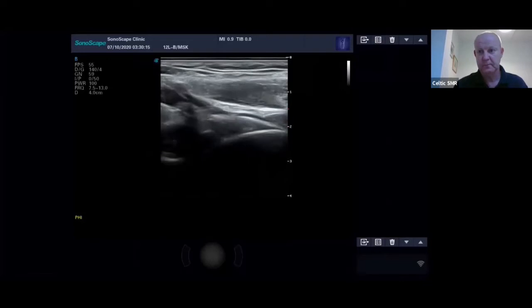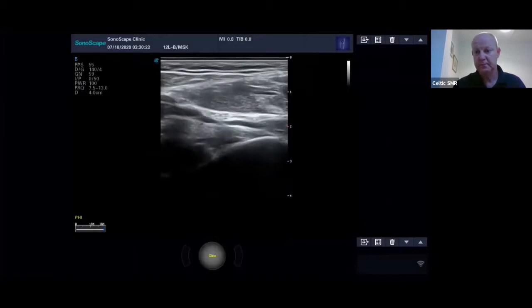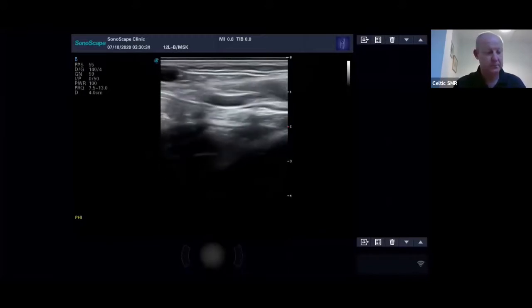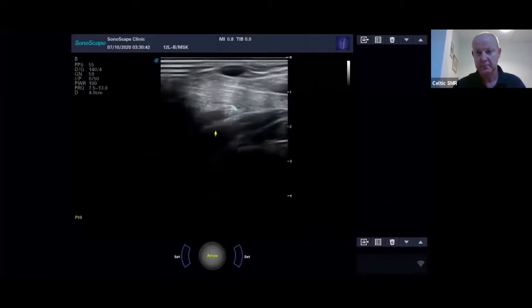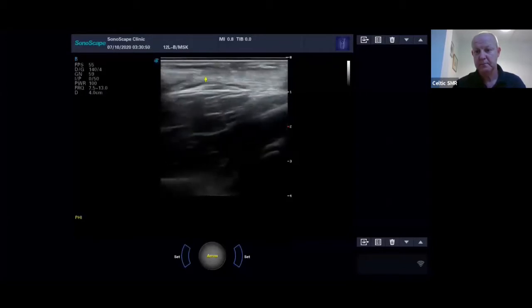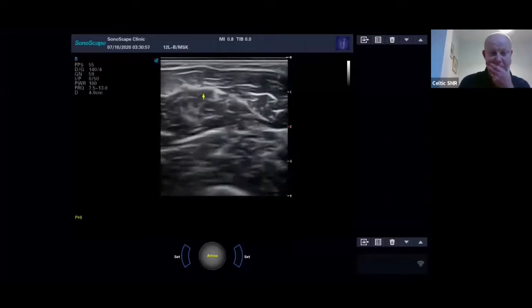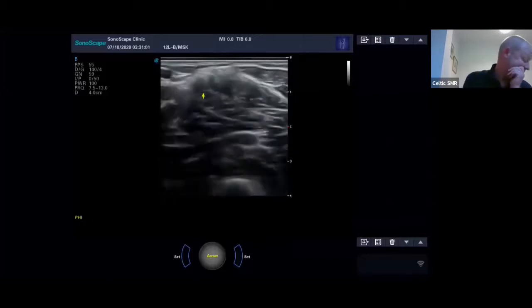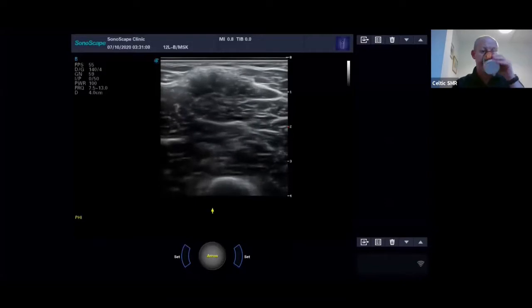So come down and so there, and there, and that's it there. I just breathe there. So this is the biceps tendon that's inserted here. It goes up. And it's quite difficult to distinguish the two of them here, and I'll show you an image as well, which shows you why. So there it is going up there. These are the tendon fibers, our biceps tendon. And that's going up. And then what I did here is turn transverse again, and then it goes into the muscle belly, the biceps. So it's a very tricky tendon to get right. But you practice it, you can get it, even though I struggled tonight.